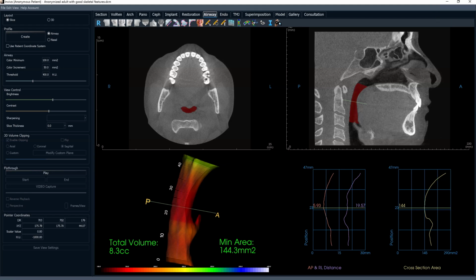If mastoid air cell opacification is noted, what is an appropriate way to document without raising major concern to the patient and provider? What clinical scenarios could it indicate? So he's asking about the opacification of the mastoid air cells. The good news is it's pretty uncommon. Almost for sure, it involves some sort of infectious process. So that's going to be the key. It may or may not be clinically symptomatic, so the patient may not even know. They may be completely unaware of it.